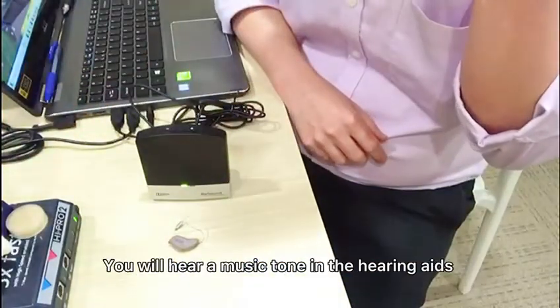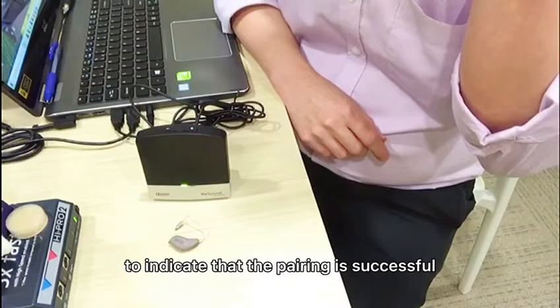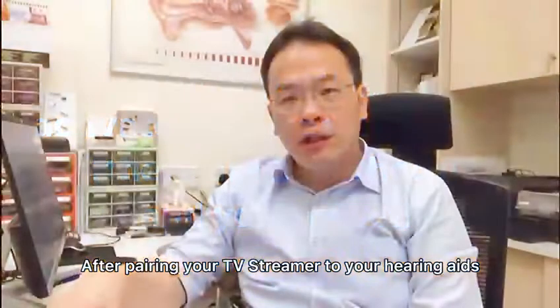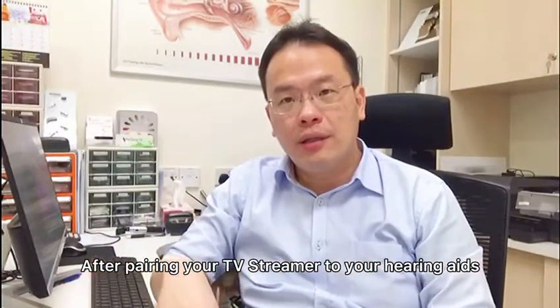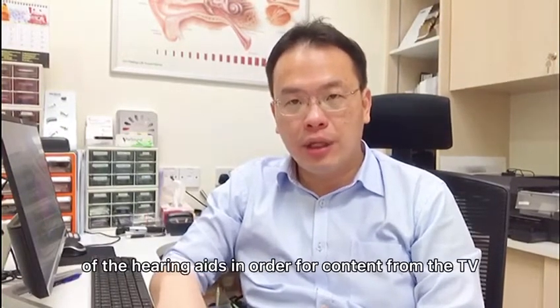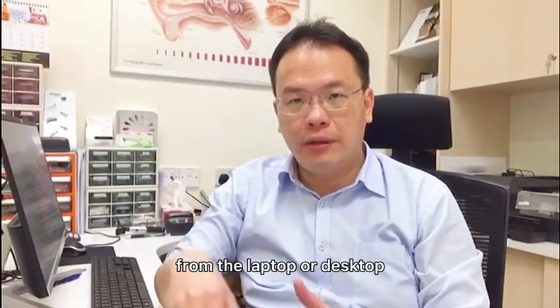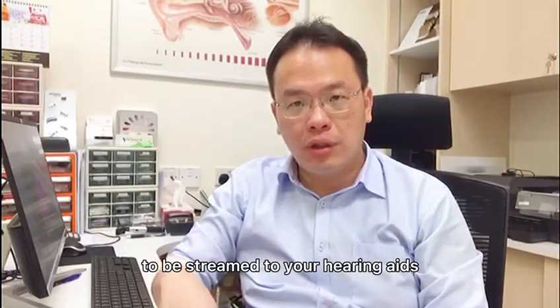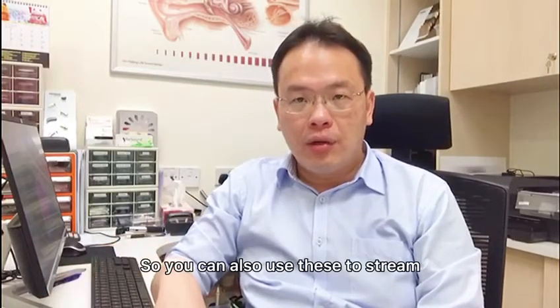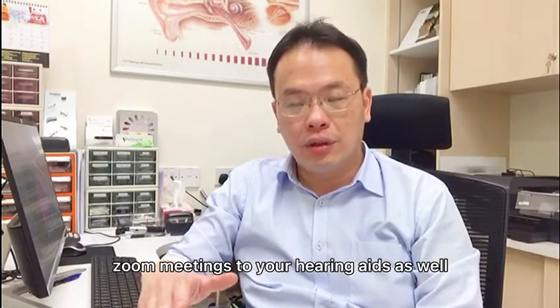When you put the hearing aid close to your ear, you will hear a music tone in the hearing aid to indicate that the pairing is successful. After pairing your TV Streamer to your hearing aid, you need to activate the streaming program in the hearing aid in order for content from the laptop or desktop to be streamed to your hearing aid via the TV Streamer. You can also use this to stream Zoom meetings to your hearing aid.